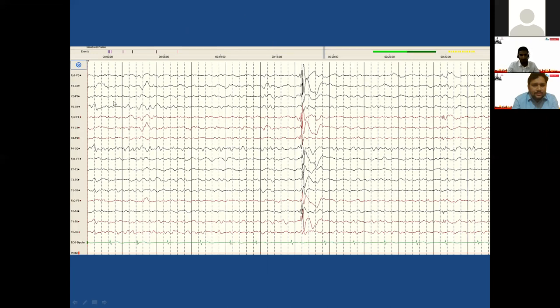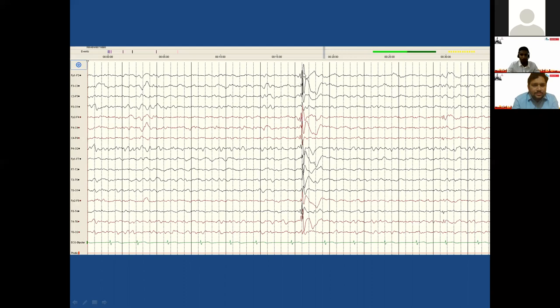Looking at this example, the background activity is in the slow theta-to-delta range, around 6 to 7 Hz — probably a sleep-like state. Then there is a sudden disruption: a spike-and-wave discharge (a sharp spike followed by a wave), then slowing for a period before returning to baseline. This is an interictal epileptic form discharge. In this case it is a generalized spike-wave discharge because it appears in all leads bilaterally — both left and right.